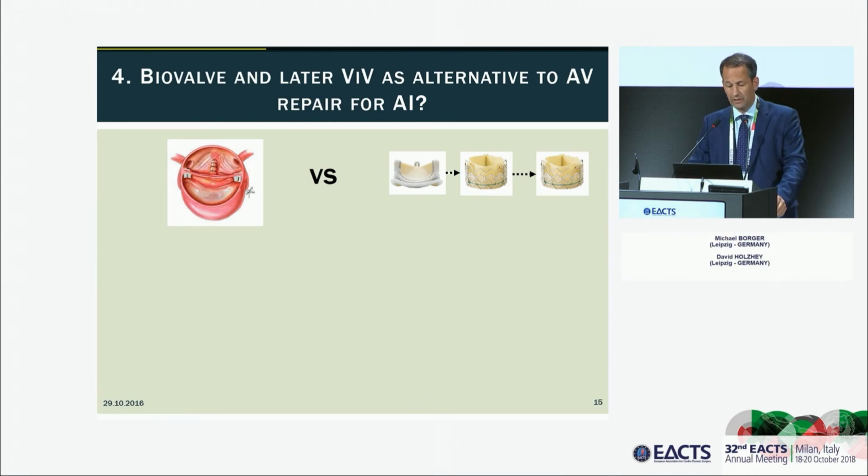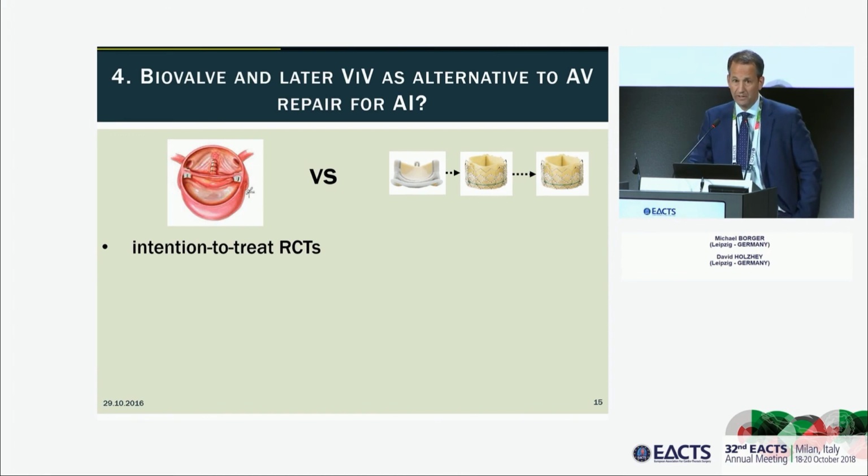Maybe we can argue that these patients should undergo a biological aortic valve replacement or bio-Bentall with planning for a future TAVI valve-in-valve and subsequent TAVI valve-in-valve-in-valve, particularly since these patients have large aortic annuli, and you can frequently replace the valve with a 27 or a 29 bioprosthetic. Again, I'm a big proponent of aortic valve repair surgery, and I do a lot of it, but this is not completely crazy thinking in these patients, because as we know, the valve-in-valve procedure is straightforward, it's quick, and it's got good results as long as the patient does not have a small aortic valve.